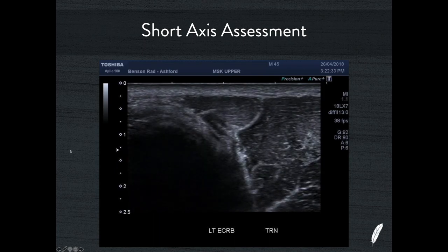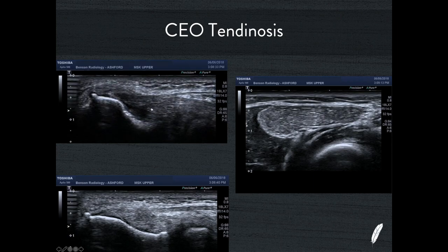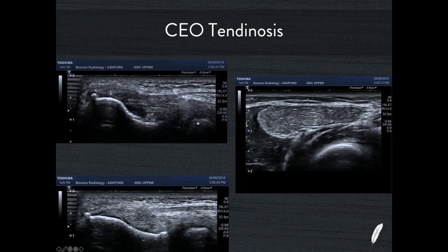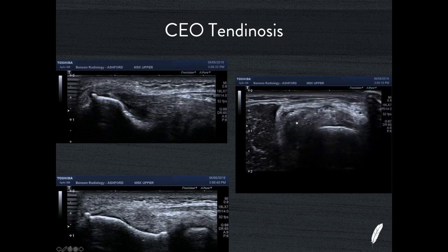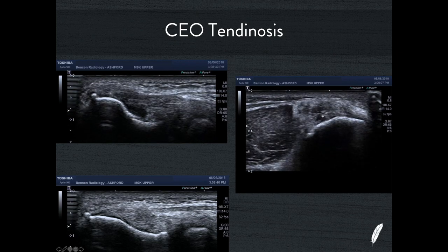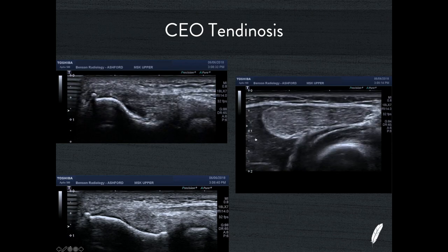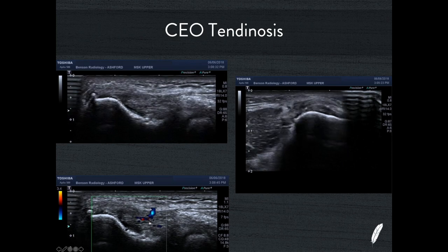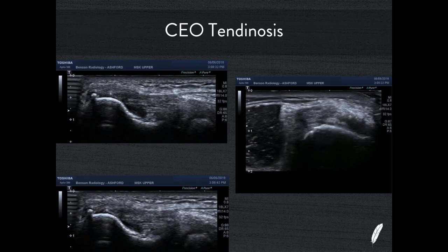This is a really nice short-axis localisation of extensor carpi radialis brevis showing it is indeed the component of the common extensor origin that is the source of the patient's pain. The image looks entirely normal at Reference Image 1, then moves towards Reference Image 2 and looks entirely pathological — healthy-appearing collagen with the radial head visible, then losing the radial head, getting to the edge of it, and pathology appears. In the short axis we follow the ECRB tendon up over the radial head onto the lateral epicondyle; the echo texture is very abnormal with hypoechoic clefts and tendinosis, perfectly localised to the ECRB component. The Doppler follows the same pattern — normal collagen, then florid hyperaemia at the Reference Image 2 ECRB component.